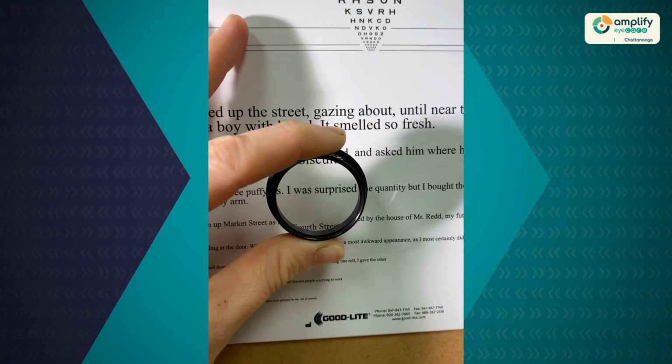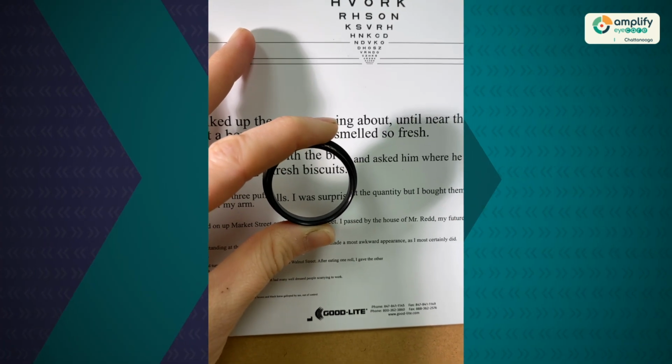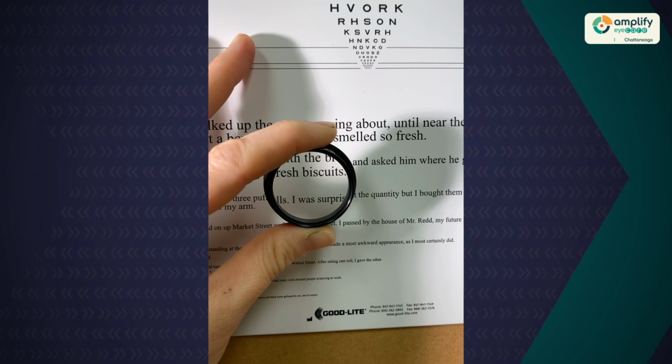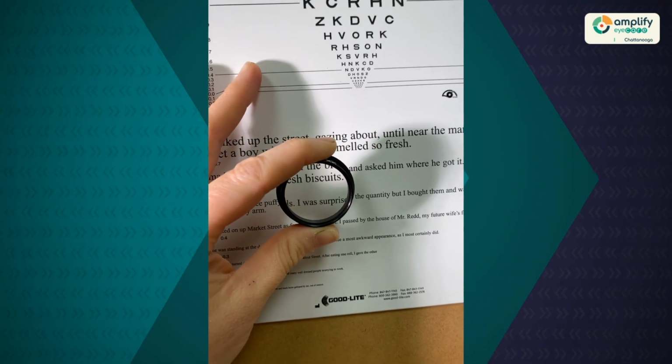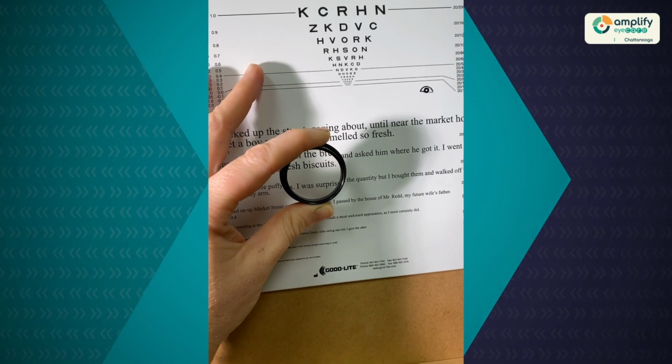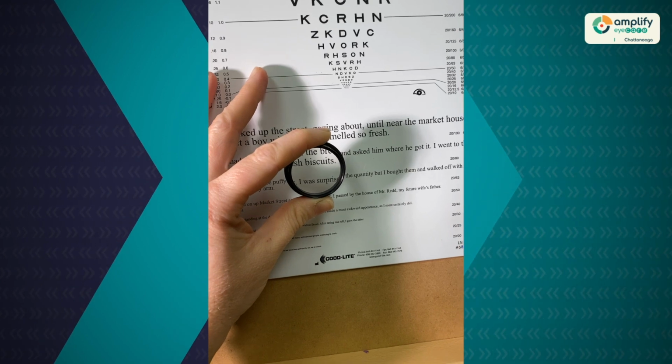What you'll notice with this one is that it has a very large field of view and it doesn't have any distortion at the edges of the microscope. But with a fixed focused lens like this, it is going to be good only for when someone is seated and reading something up close. They would have to remove the lenses before they got up and started moving around.